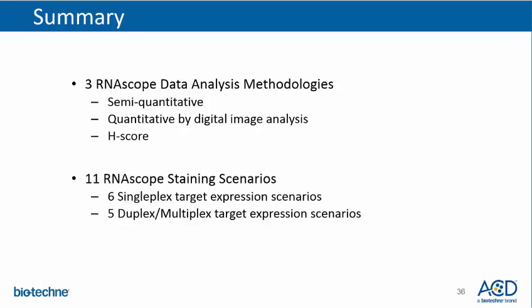To summarize, we discussed 3 generic RNAscope data analysis methodologies that can be used across multiple research applications to answer different types of research questions. And we provided examples for 11 staining scenarios.